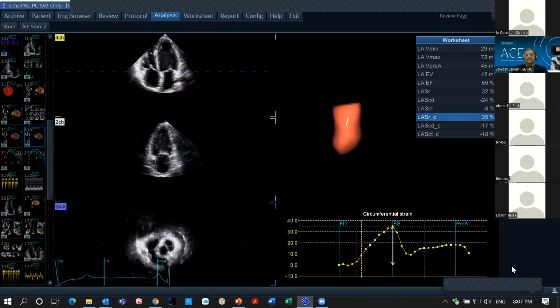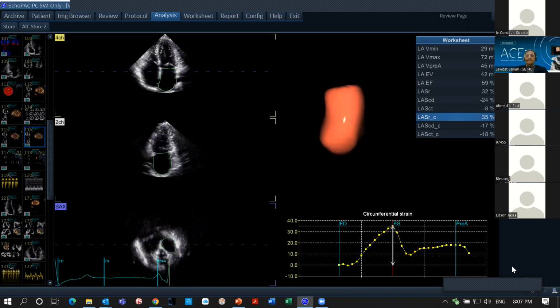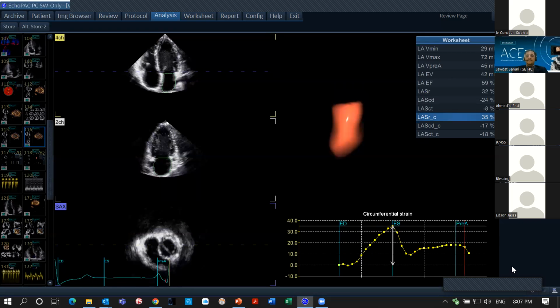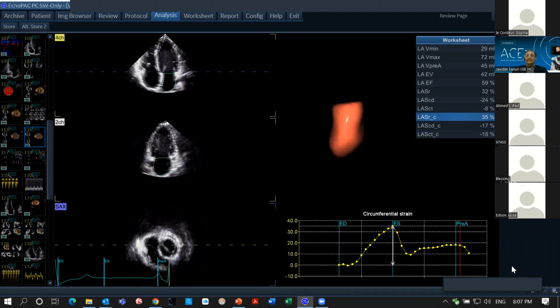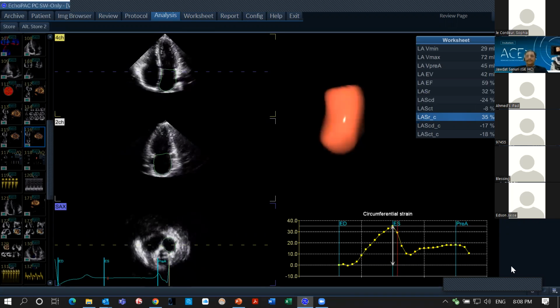In the American Society of Echocardiography, there is one large study that validated from 35 to 24 as impaired relaxation. From 24 to 19%, it is a pseudo-normal pattern, and less than 19 represents a restrictive pattern. But this is not validated in the guidelines. It is only from studies. Okay, great. Thank you for sharing that, Doctor.